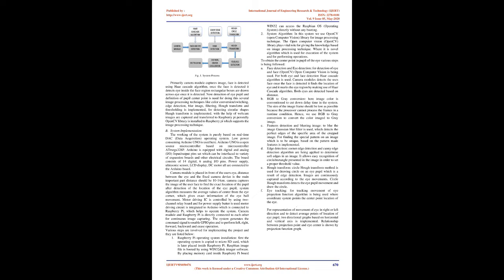10. A power assisting control system with driving assistance using monocular fisheye vision for an electric wheelchair is implemented for highly disabled persons. The fisheye camera is mounted on the front part of the robotic wheelchair to capture the image of the eye pupil, with direct drive motors for wheel actuators. An RT-preempt patched Linux PC and an image processing PC are placed under the seat for the motor controller. The distance to be traveled is calculated based on the optical flow vector, OFV, calculated from the floor area in the fisheye image. The electric powered wheelchair moves from one particular area to another.